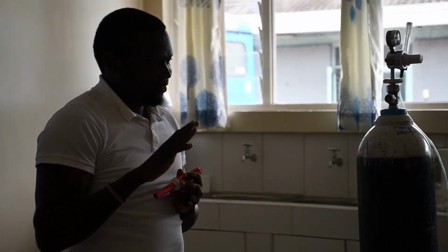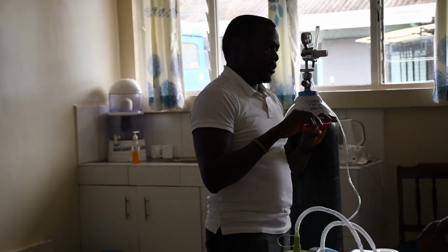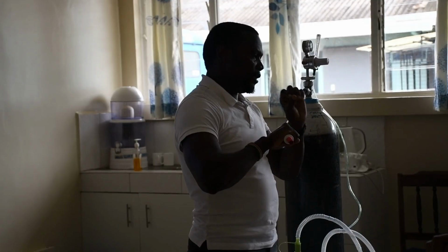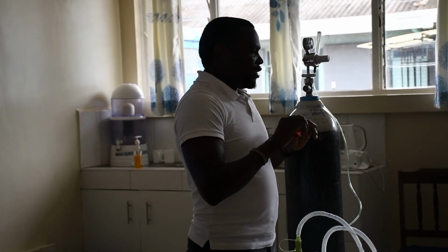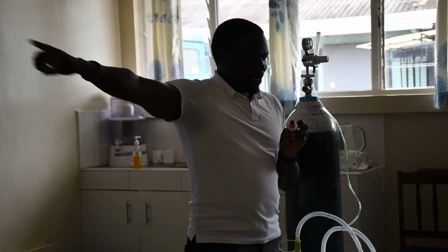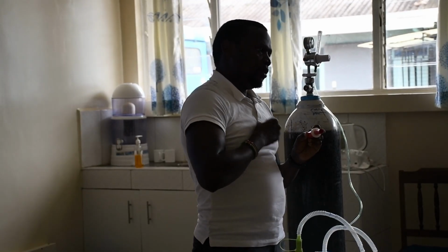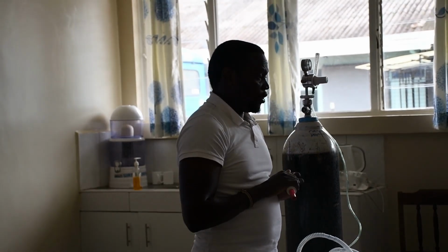Sometimes when you train some people, they tell you that gases will escape because they hear that sound. It's a blending sound. The laws of physics will never allow gas flowing at a very high velocity to get out. It's only going to suck whatever it can from the ambient environment into it.